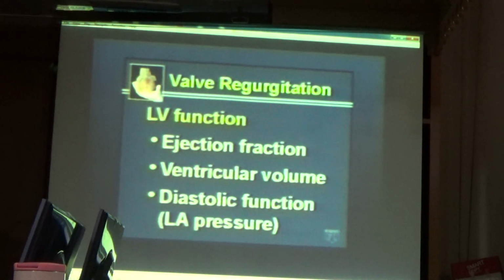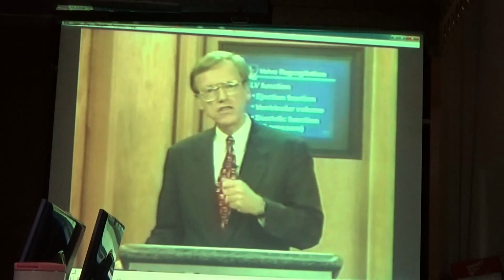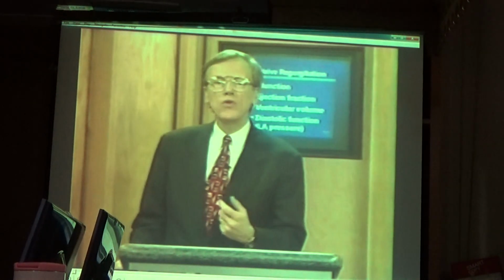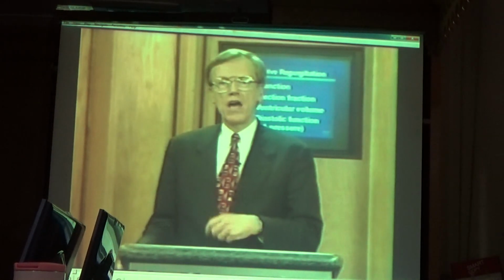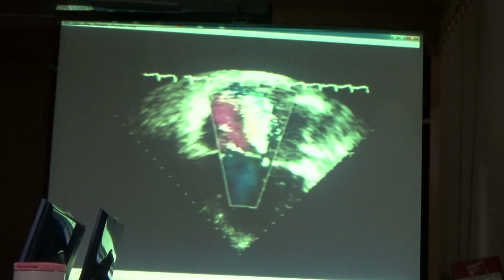Lastly, diastolic function, which will be illustrated later in this session, does have an indicator of early ventricular dysfunction, and can help you make decisions regarding prognosis, but again, once they're present, it is often a little bit too late in the process. Now, if we look at our techniques, color flow Doppler and echocardiography, this is an apex down view of the left ventricle, and we're all familiar with the color flow features of mitral regurgitation as exemplified here.